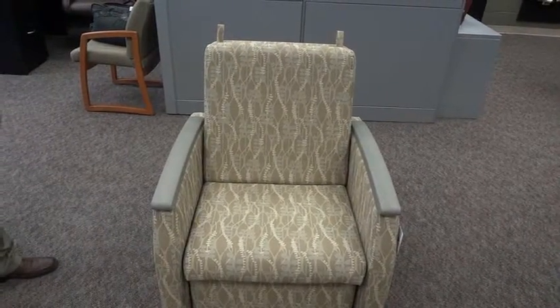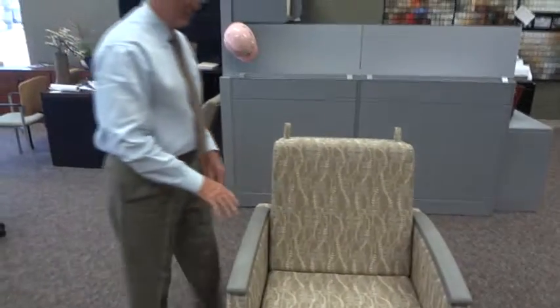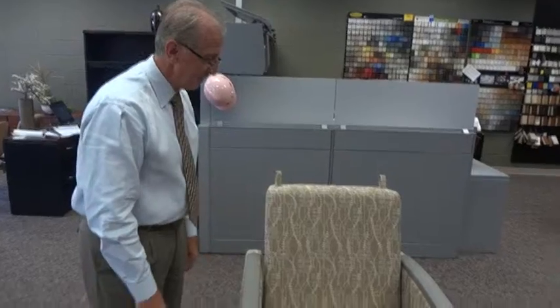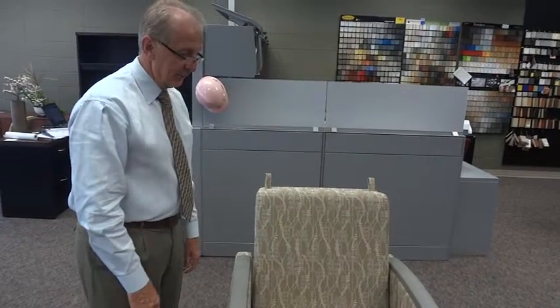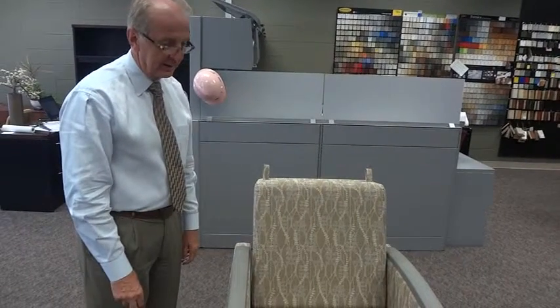What we'd like to do today is demonstrate the actual operation of the PrimaCare sleeper. The first step in understanding the operation of the sleeper is to note there are four locking casters on the sleeper. If you depress with your foot, that will lock the caster in place. If you pick up on the caster, the chair will move.